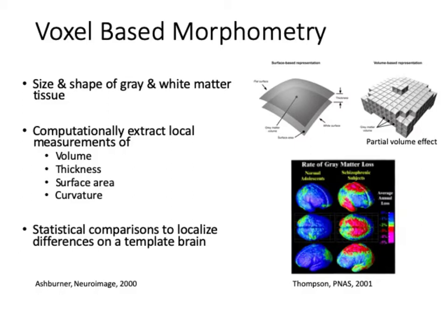Once the mathematical representation of these surfaces is obtained, it is a trivial matter to obtain the thickness, which is the spacing, the distance between these two surfaces. So voxel-based morphometry software that I will describe will perform this analysis either using the volume-based approach, that is to get tissue volume measurements, or the surface-based approach, which is to get thickness measurements.